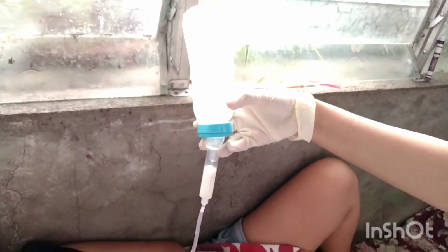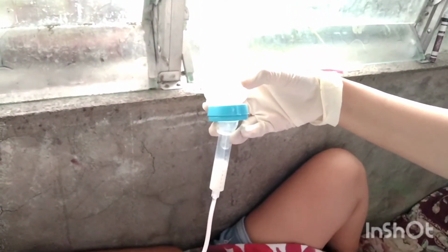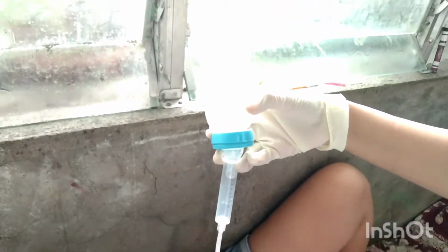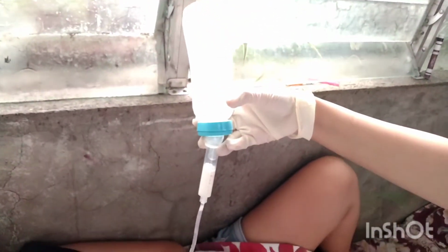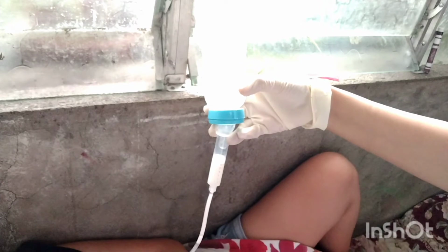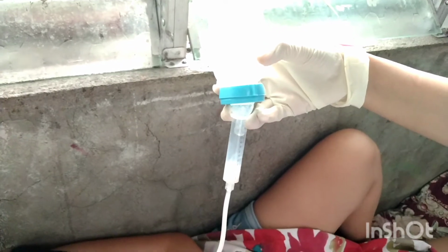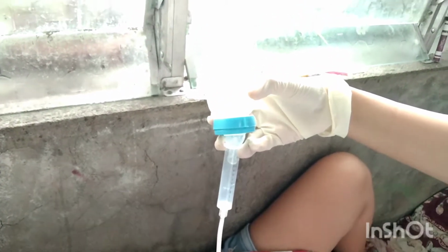Next, continuous drip method. Hang feeding bag and tubing on IV pole. Connect distal end of tubing to the proximal end of the feeding tube. Connect tubing through infusion pump and set rate. Continuous feeding method is designed to deliver prescribed hourly rate of feeding. This method reduces risk of abdominal discomfort. Clients who receive continuous drip feedings should have residuals checked every 4 hours and tube placement verified.